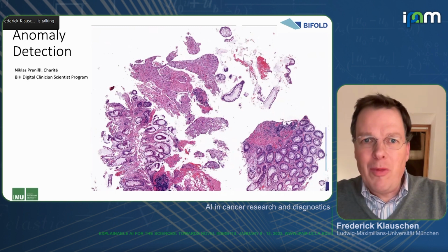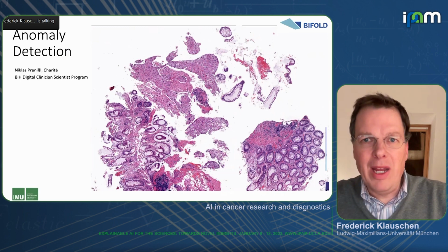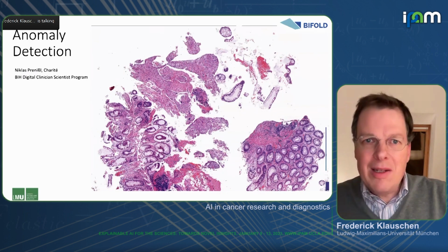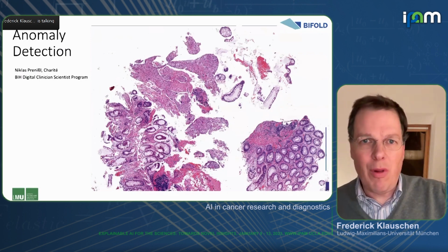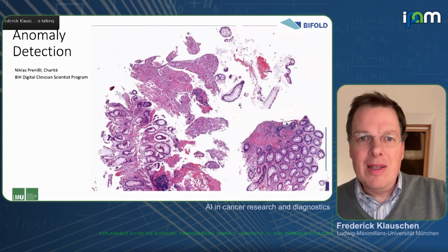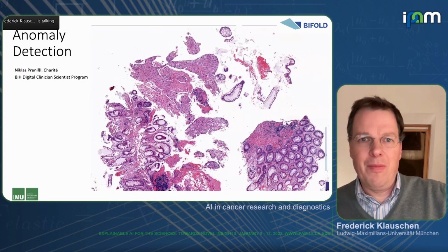And there are so few cases of it that it would be practically impossible to train your AI to really clearly detect this as stomach cancer. But with the anomaly detection, you can highlight this region and then have an expert pathologist further review the slides, making it easy not to overlook such an important finding here.